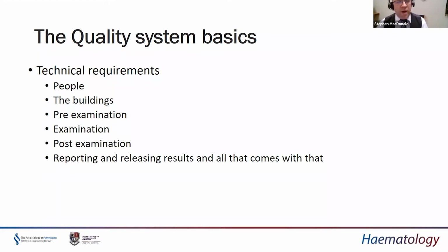And then the familiar processes that have been followed on through the CPA process of pre-examination. What happens from when the sample is first taken from the patient? So that might be out in the community, that might be in what we call in the UK general practice.